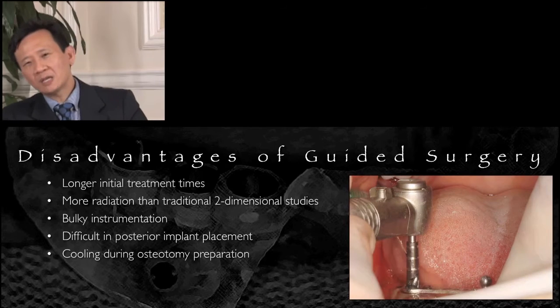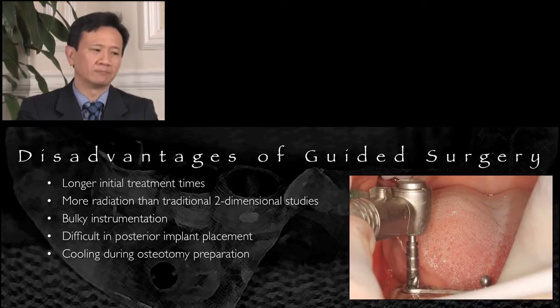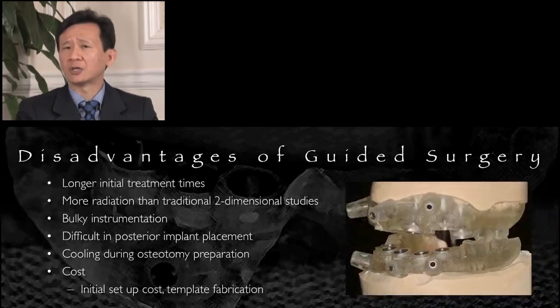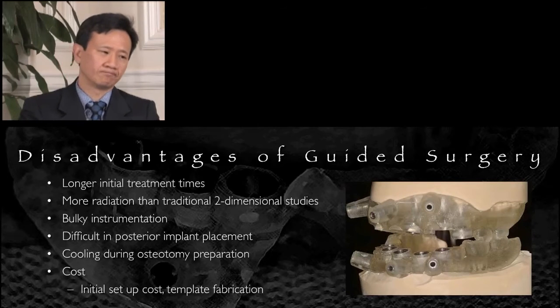And many clinicians are concerned about cooling. Cooling of the instrumentation during the osteotomy preparation, cooling it through the surgical template, and also cost. Initial cost setup based upon the cost of the program, and also for CAD/CAM templates. Who pays for it, and how is it completed?